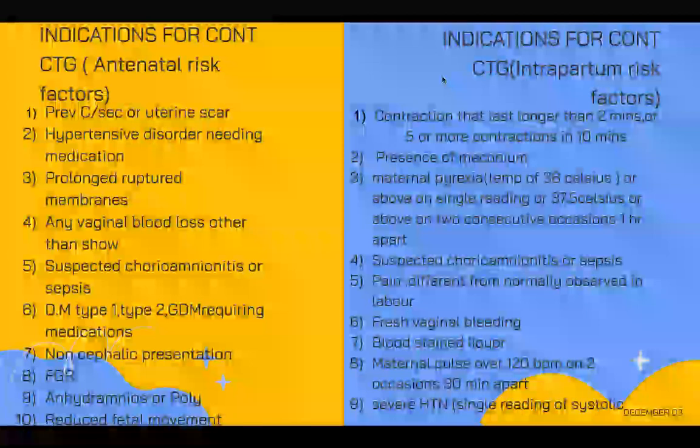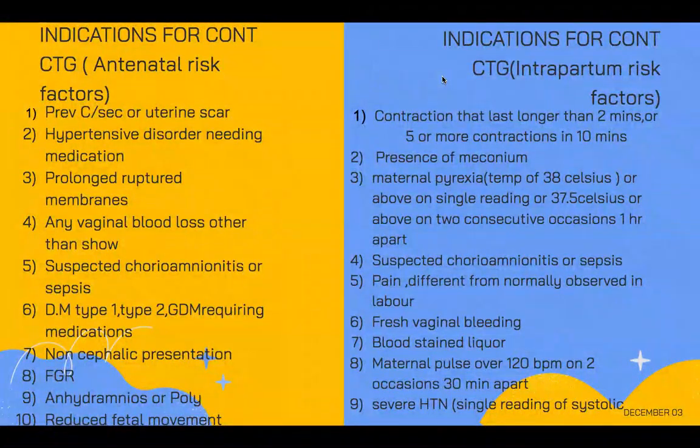Listen, whenever there is any situation in which fetal hearts are not audible properly, then definitely you have to go for the continuous CTG. But when fetal hearts are audible at the BMI of 35, there is not an indication for continuous CTG, right? Am I clear now? So it means if in the exam the scenario is there, then we choose the intermittent auscultation. It has not been mentioned over here. But listen, they may have put some other things as well. It will not only be the BMI of 35. This is the reason I'm saying, read the whole scenario. Then you have to figure out what exactly you have to choose. At the end of this discussion, you will have a very clear idea of what you have to choose, right? Just keep the flow with me.